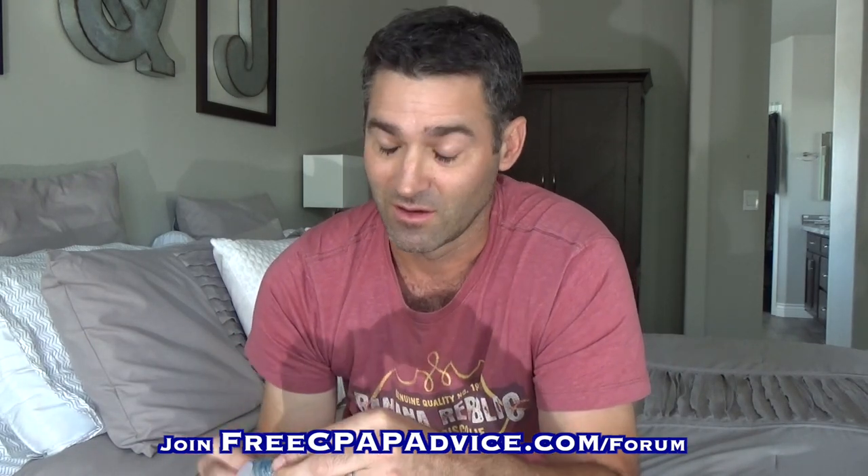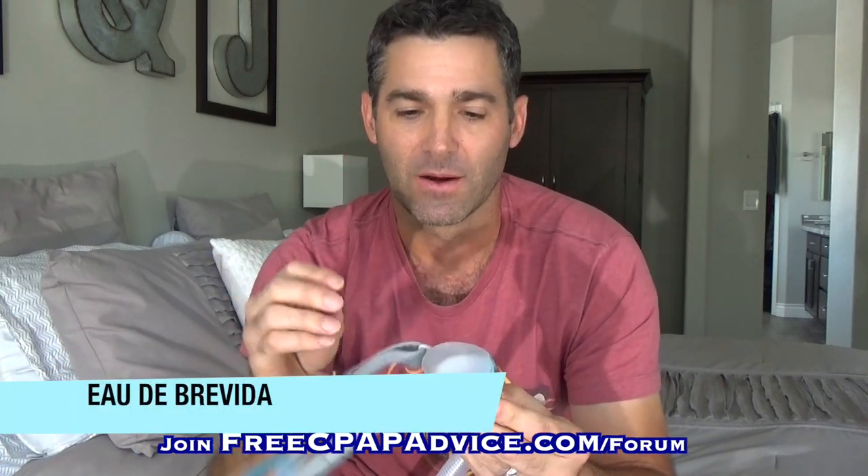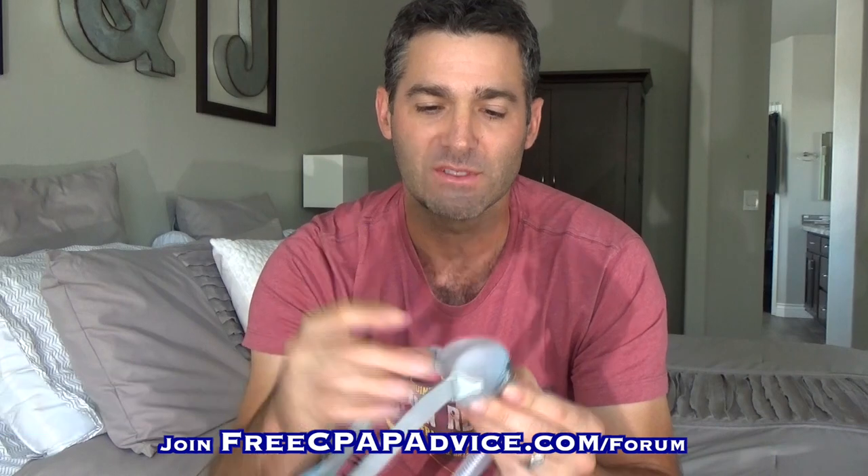Anyway, they made some improvements and now they're calling it the Brevida. I don't know what that means. The first thing is they made a lot of adjustments to pretty much everything, but the essence of it is still pretty much there. The shape of this is very much like the Pilairo.